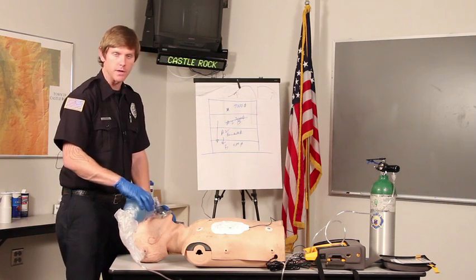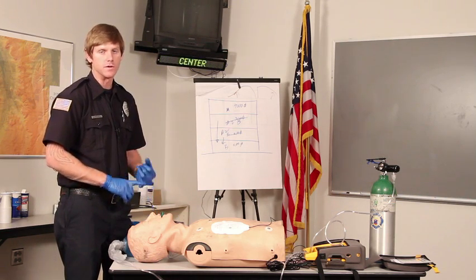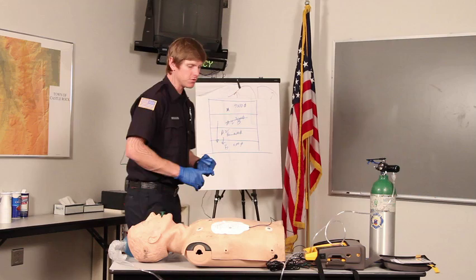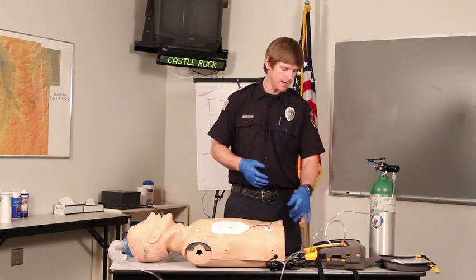Along with good airway management, you're also going to be in charge of making sure your partner and or the bystanders are doing adequate CPR, which means the appropriate rate and depth. After 2 minutes, you'll clear everyone again off the patient and you'll reanalyze using your AED.